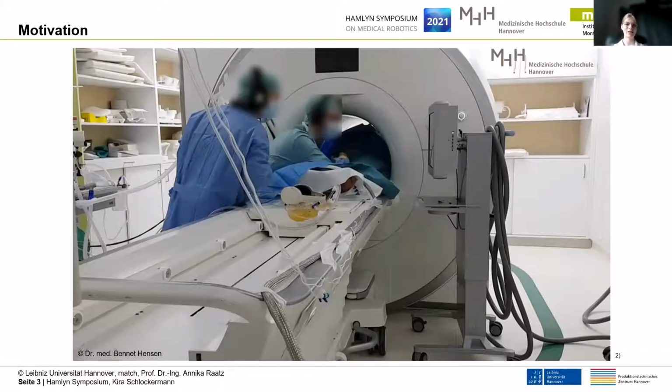Like we can see in the figure of the Hannover Medical School, the procedure is non-ergonomic for the interventionalist and not automated. The robot is therefore intended to facilitate the intervention in a limited space.